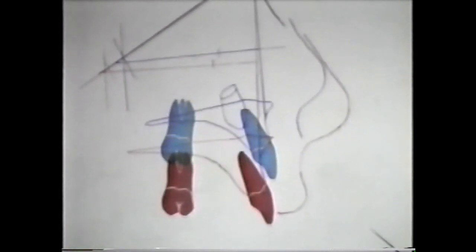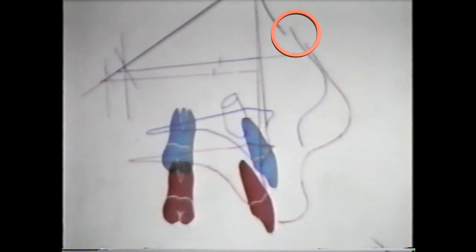Now if you notice here, point A has gone back. Look at it. Anterior nasal spine has gone back. Now this is long range. These people, this is dominated by females. There's 15 females and 4 males. So you notice the nose is almost touching up there, even after 10 years. So there was something going on here that is permanent.